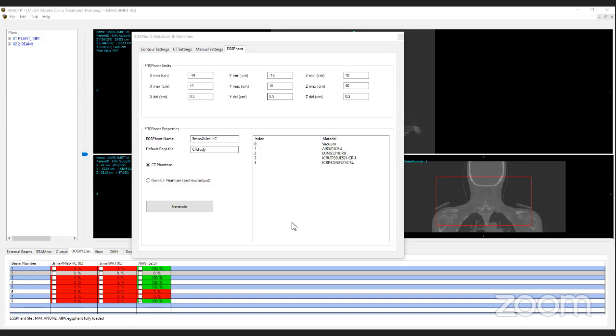What's the treatment planning system? It's Pinnacle. No, Precise Plan. Precise Plan. Okay, I have no experience with it, and I don't know if anyone has used it. Besides, it works. You can export as DICOM. Yes, DICOM RT. You should export the images, the dose, the plan, and the structures, four things.